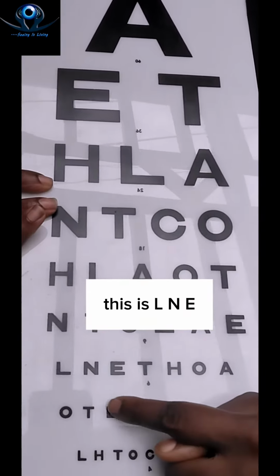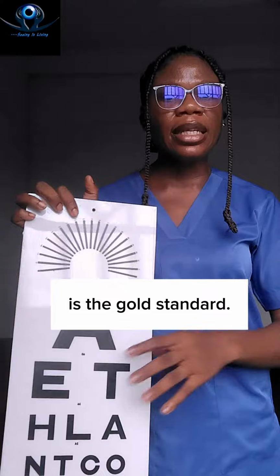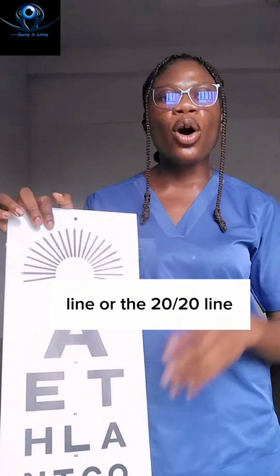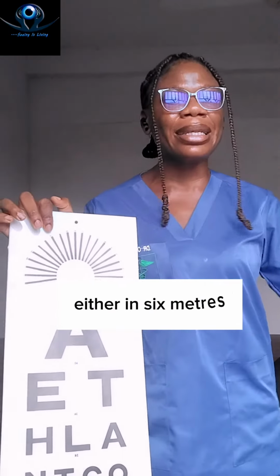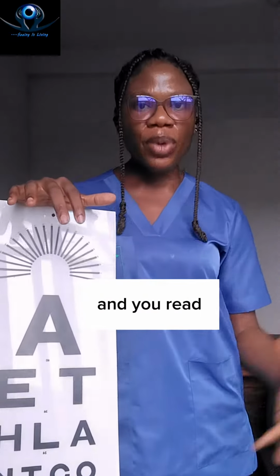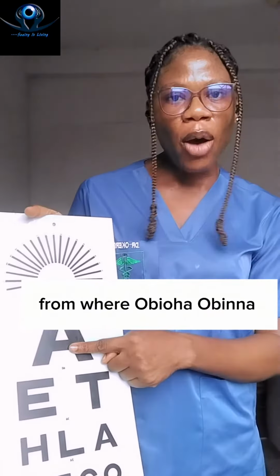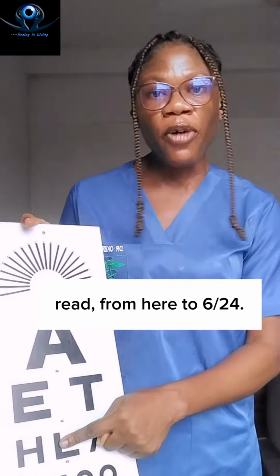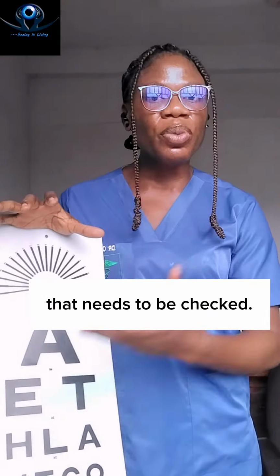Now going down to this line. This is L-N-E-T-H-O-A. This line is the gold standard and it's called the 6/6 line or the 20/20 line. Remember, I said the distance is usually measured either in 6 meters or 20 feet. Now, when you are a patient and you walk in that day and you read up to the 6/6 line, it means that your vision is okay. From where Obioha Obina read, from here to 6/24, if it were an exam that he sat for, we would give him an F9. This can be an indication of a refractive error or other underlying visual disorder that needs to be checked.